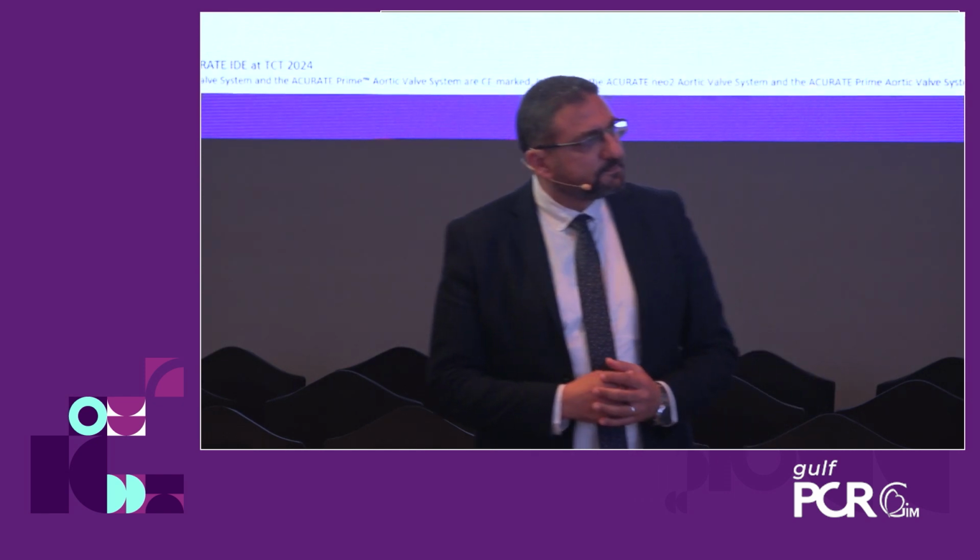I think we follow the same, that we don't really pre-dilate with a lot of platforms unless it's bicuspid or heavily calcified or we see the pigtail, how it crosses. But post, we're trying to push for it because even a mild paravalvular leak is not really that benign. Especially as we're treating younger patients and we need really as good outcomes as possible for these. So we're pushing more of post-dilation for these patients.